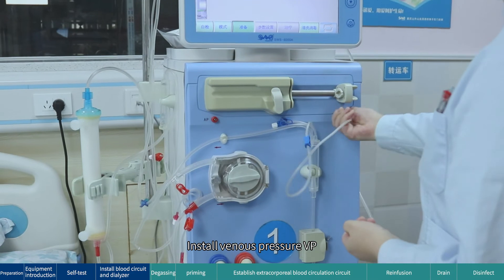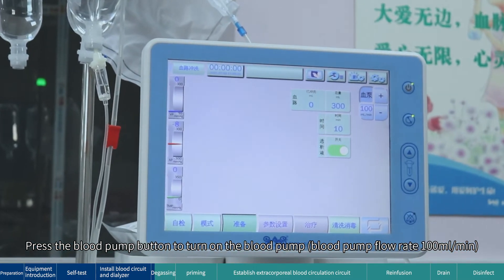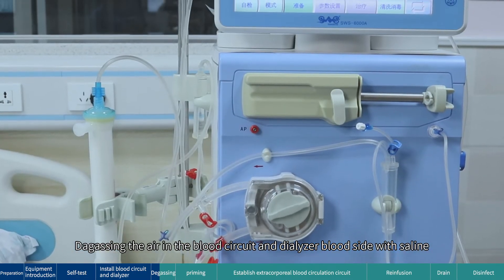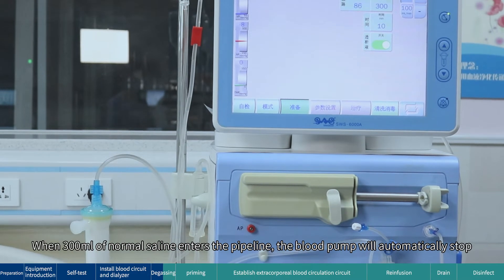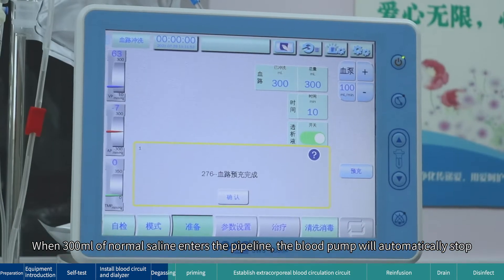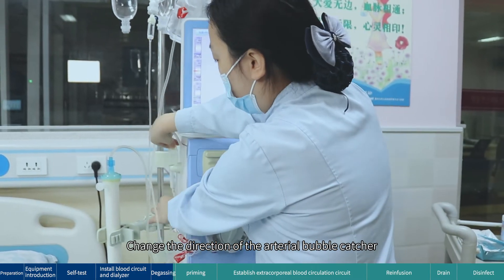Install venous pressure (VP) degassing. Press the blood pump button to turn on the blood pump at a flow rate of 100 mL/min. Degas the air in the blood circuit and dialyzer blood side with saline. When 300 mL of normal saline enters the pipeline, the blood pump will automatically stop. The machine prompts: prime finished. Change the direction of the arterial bubble catcher.